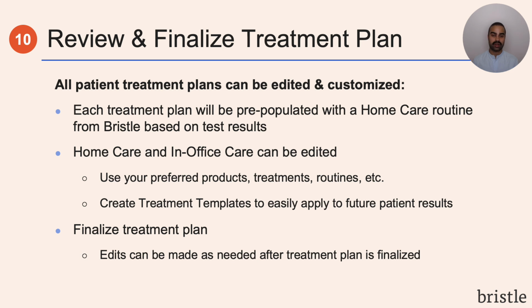So let's say you have a standard protocol for all of your gingivitis patients or all of your high caries risk patients. You can create one template for that treatment and then quickly add that treatment plan to any future patient results, all just with a simple 2 clicks. Once you select Finalize Care Plan, it'll be marked complete, but you can always go back and edit it if needed.